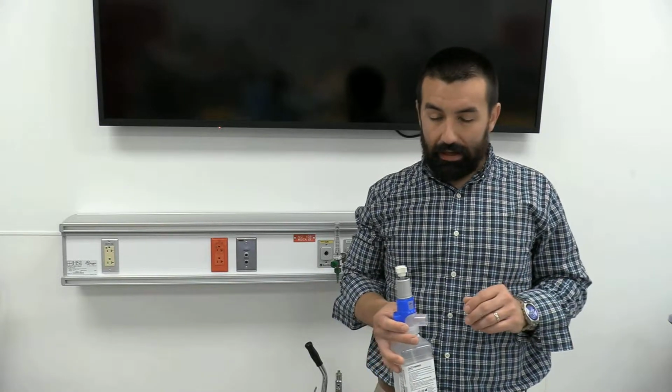Hey guys, I'm gonna do a video here on the large volume nebulizer. We'll talk about what a large volume nebulizer is, some of the common indications or situations in which we find ourselves using them, how to build a circuit, and then talk about a little bit of miscellaneous stuff here.